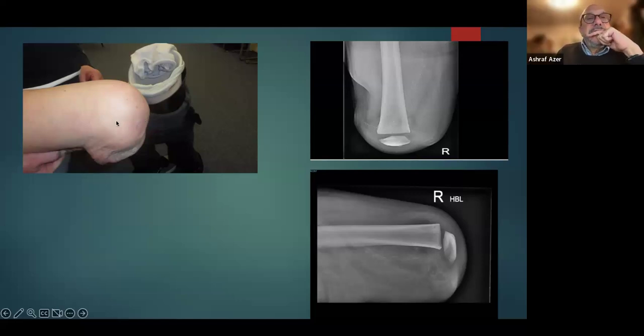This is if you decide to keep the patella. I have a long presentation on whether to keep or to remove the patella. So here he decided to leave a long sleeve, so it acted like a short transtibial, which added to the length of the prosthesis. And what is this type of through knee? It's well known in your orthopedic books.